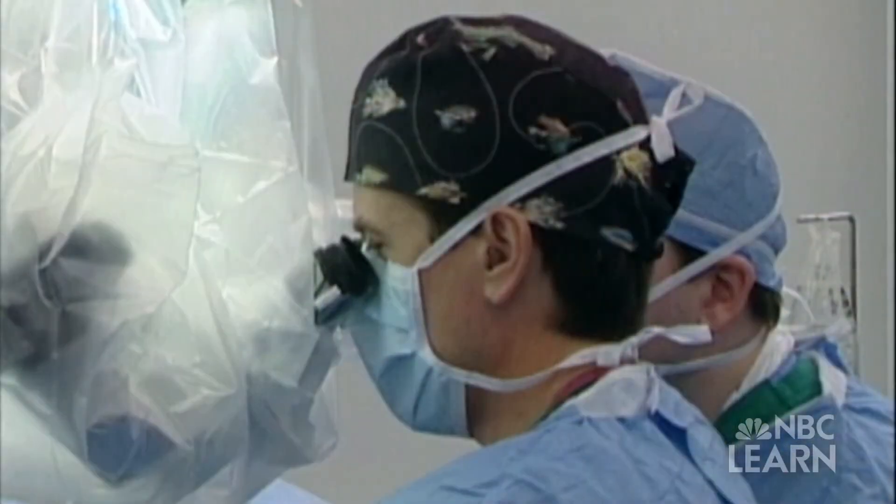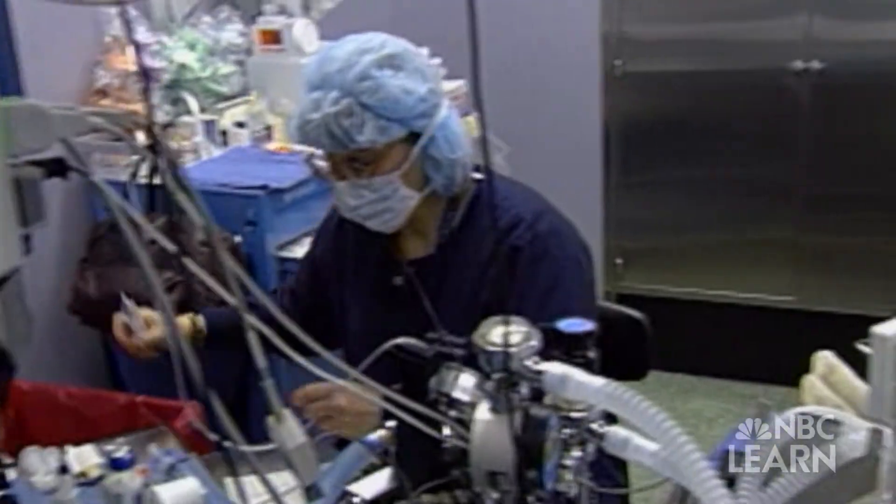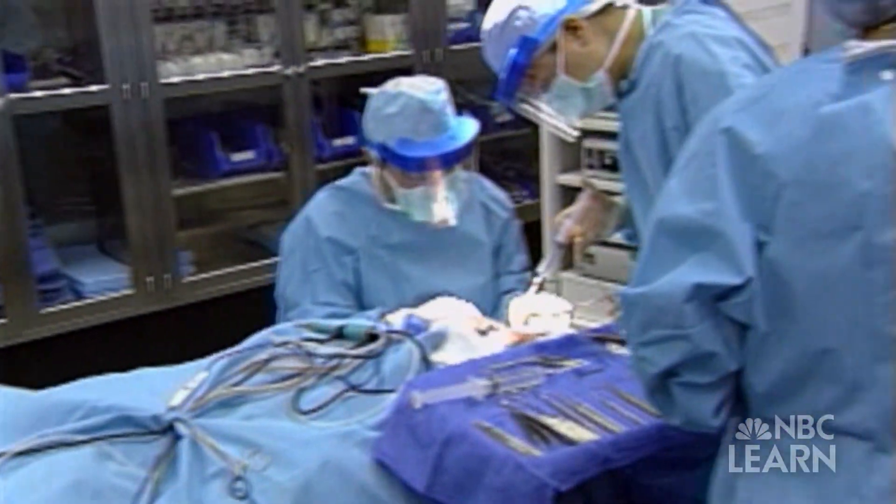Johnson's next step is to secure approval from the U.S. Food and Drug Administration so that one day in the not-too-distant future, doctors will be able to implant her technology in humans.